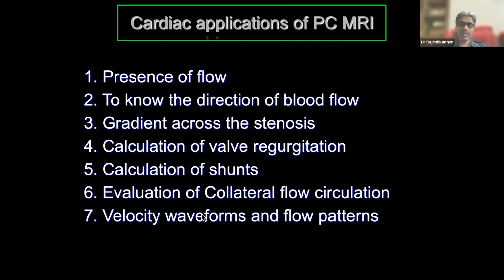That will give you images with different Vencs, so that we can correctly identify the right Venc to use. But the only thing is, for each and every structure we have to use that Venc. If you are using a true cross section, then that is okay, whereas for an unknown structure, of course you have to use one additional sequence.